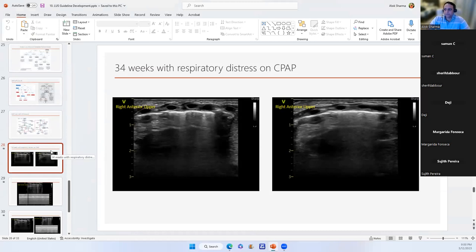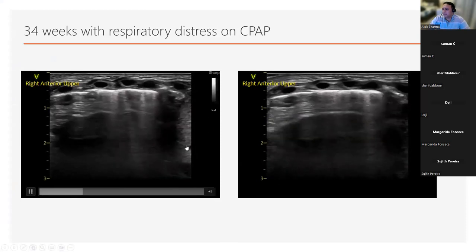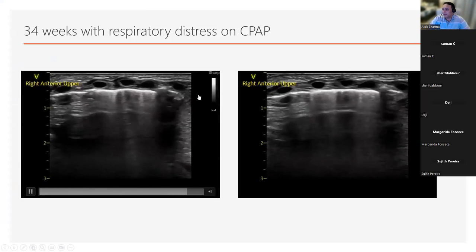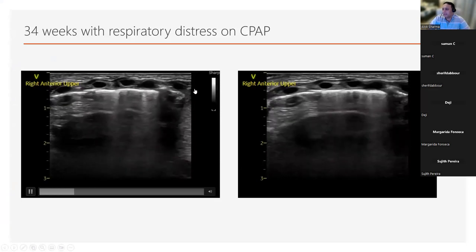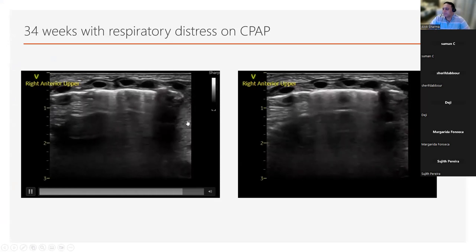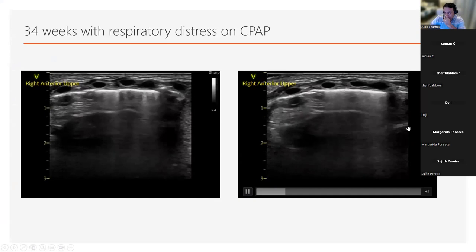Okay. My question is about the rightmost end here. It looks like some AIS like picture. Just a query. This bit? Yeah. That's liver. This diaphragm, that's liver. Okay, it's covering this entire tissue thing.